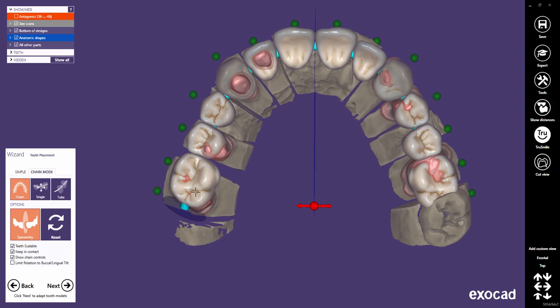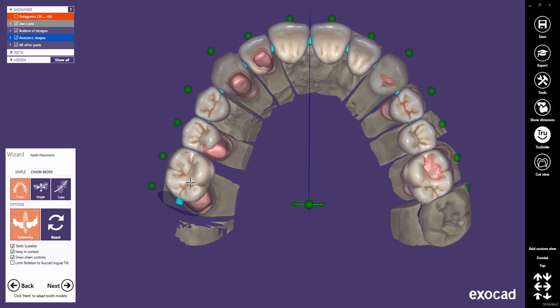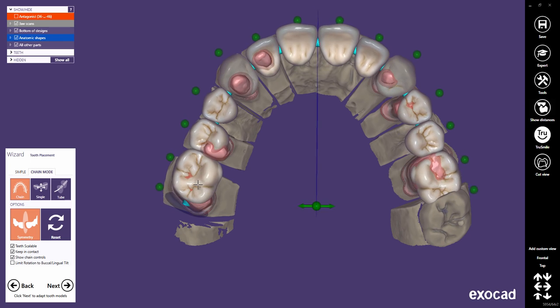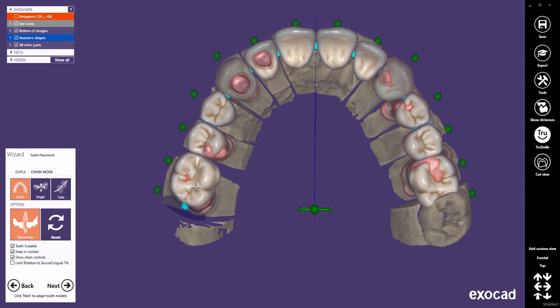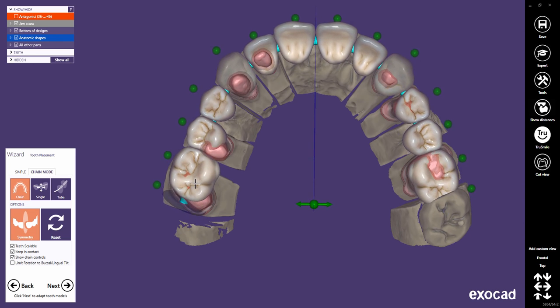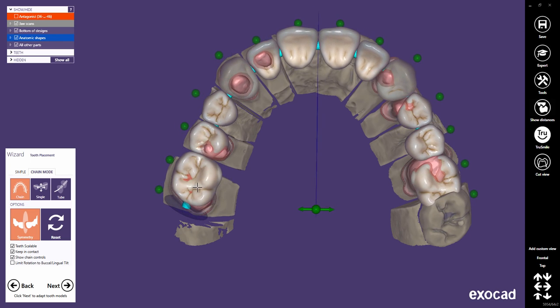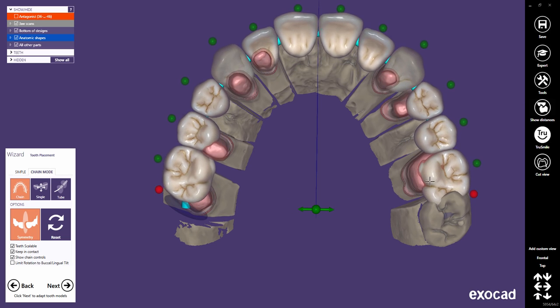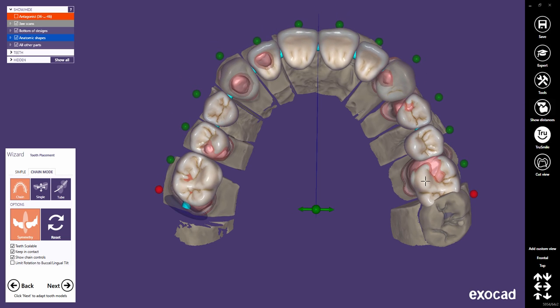If we unlock the symmetry plane and no other point is locked, the whole tooth bow will be moved. Let's play around a little with chain mode and overall symmetry.